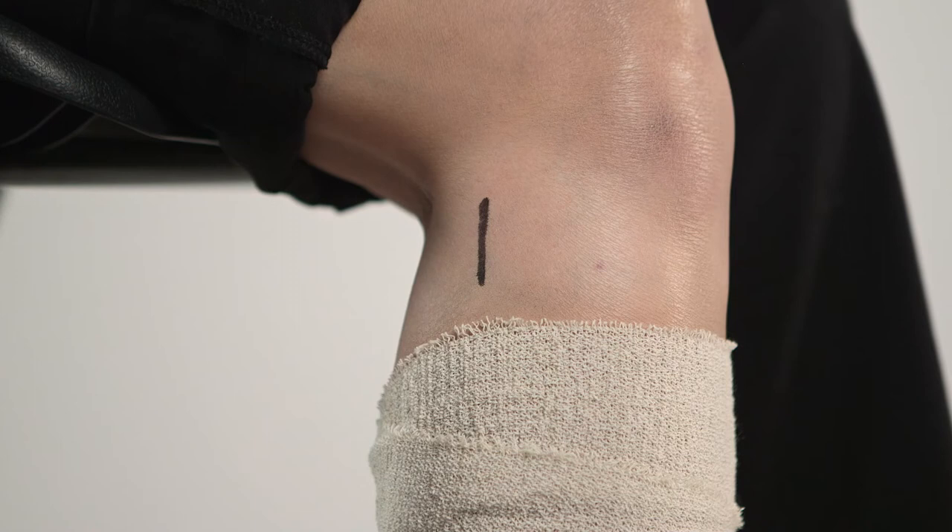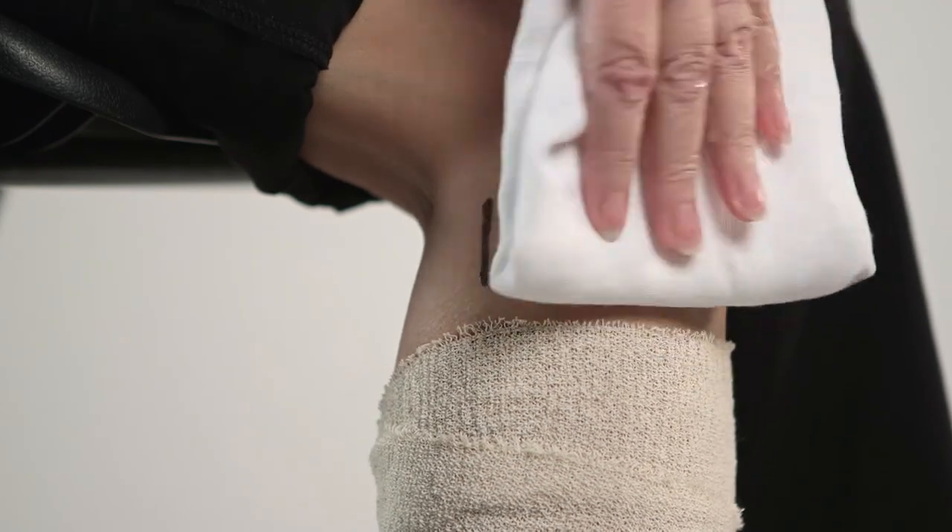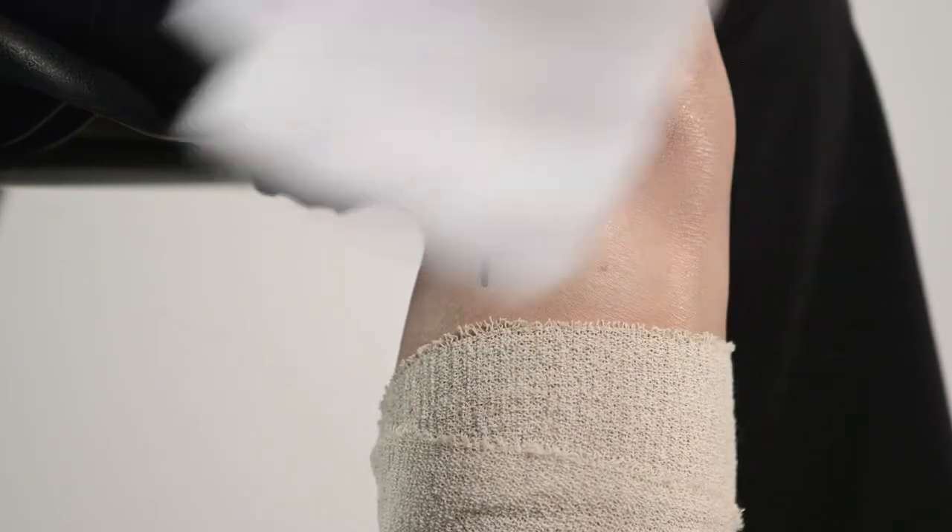Excess hair may be removed using trimmers or clippers. Avoid shaving, as this may damage the skin and increase the risk of skin irritation.